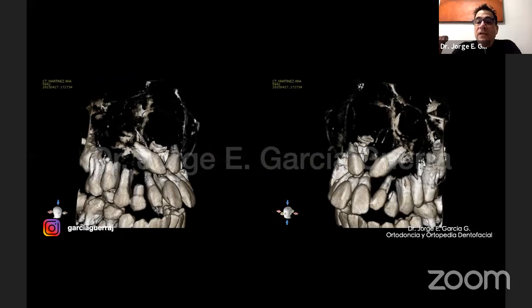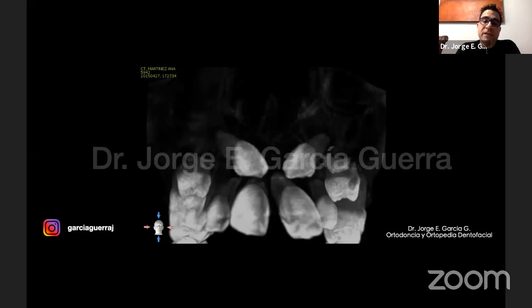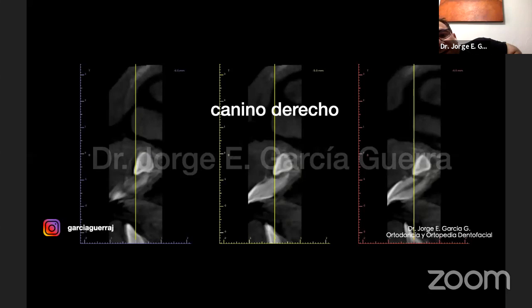It looked easier, but it was a little bit more difficult to move that. Now in this case, we did the same approach that we did on the previous patient. Okay, we decided on this case we put the mini implants, but what we did was started to move it with a Vista. I learned this from Dr. Chang. This is a Vista kind of flap. You can see that. Okay.